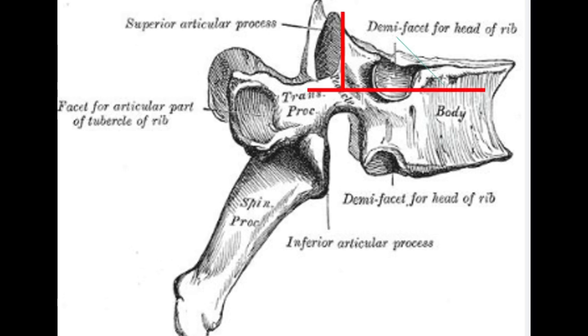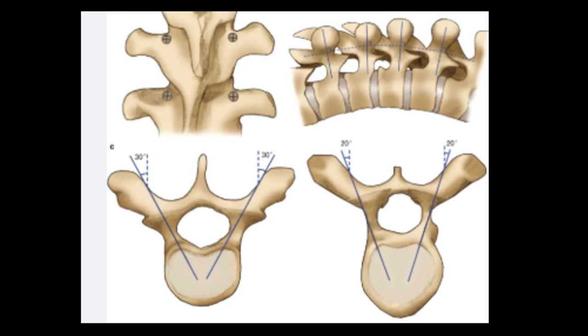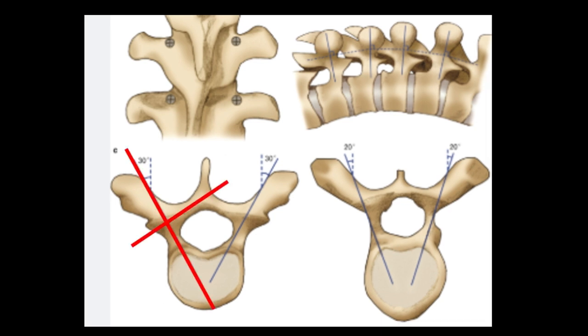So if you know the plane of the superior articular facet, and you stay perpendicular to that, you are going to be parallel to the superior end plate and in an acceptable trajectory. In another figure from a paper, you can note that the lamina is at an angle of 90 degrees to the pedicle axis. So this is another thing which we are going to see.